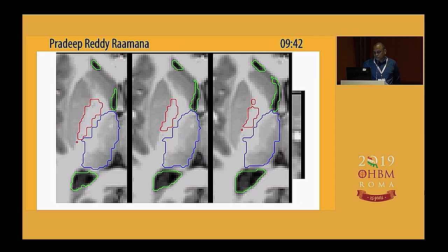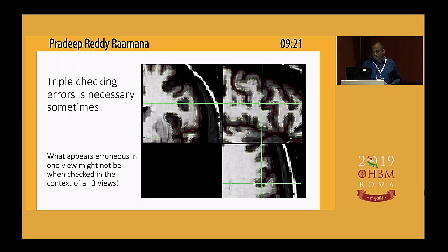And these are more examples for subcortical volumes. In this case, for example, I think these two areas are erroneous, right? And even for lateral ventricles, which are actually often quite easy to segment, there are issues with FreeSurfer due to many reasons. So you need to visually review them for accuracy before any important analyses.